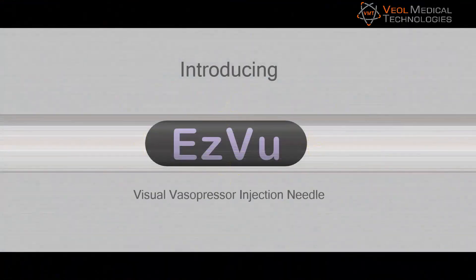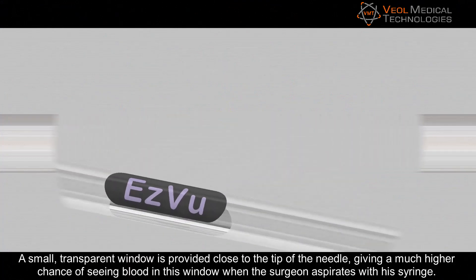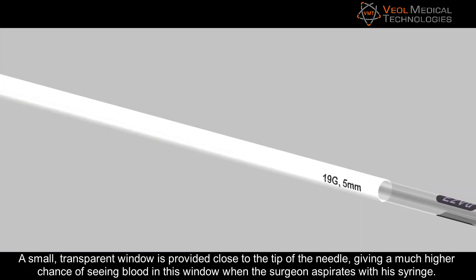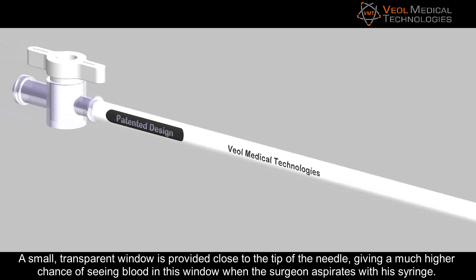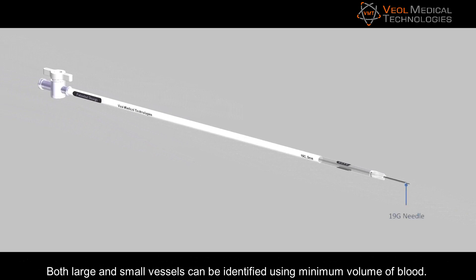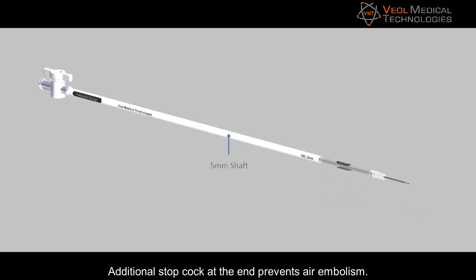Introducing the Easy View Visual Vasopressor Injection Needle, an innovation by Dr. Sanket Pisat. A small transparent window is provided close to the tip of the needle, giving a much higher chance of seeing blood in this window when the surgeon aspirates with the syringe. Both large and small vessels can be identified using a minimum volume of blood.